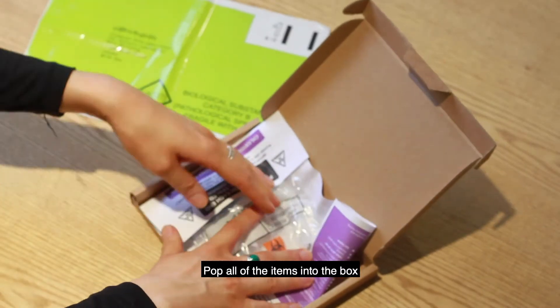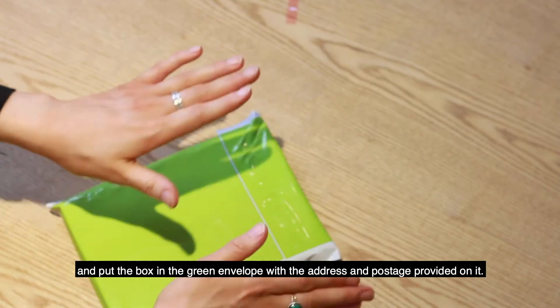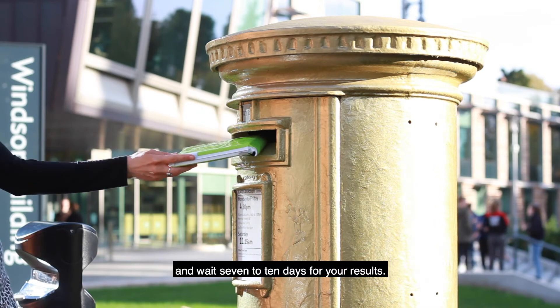Pop all of the items into the box and put the box in the green envelope with the address and postage provided on it. Simply put your completed test in the nearest post box and wait seven to ten days for your results.